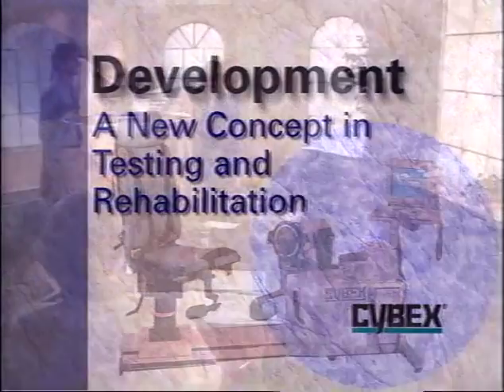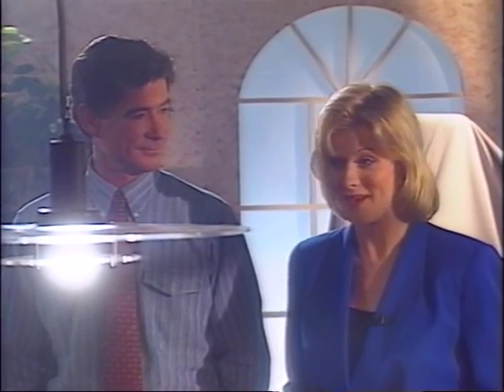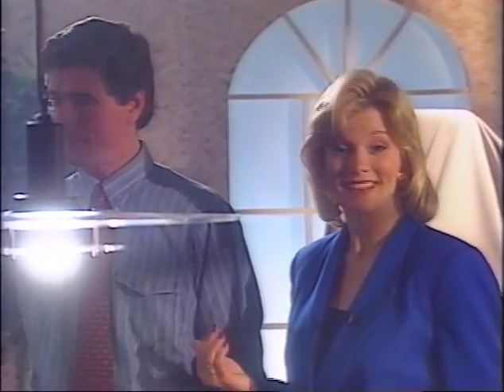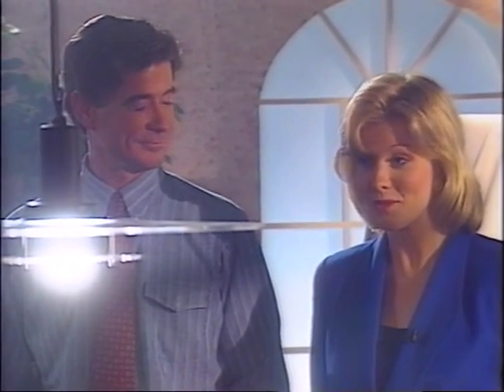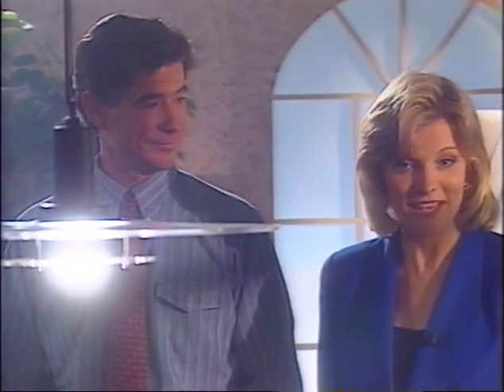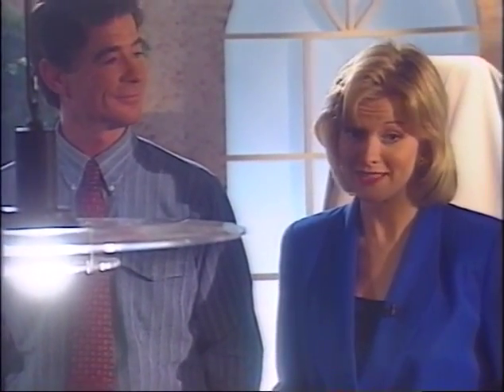Well, I see everyone is here. Why don't we get started? I'm Allison Cartwright, responsible for marketing and research at CYBEX, and this is Tom Essex, our design engineer. Before we introduce CYBEX's new testing and rehabilitation system, I'd like to take you through the development process and explain some of the challenges we faced.